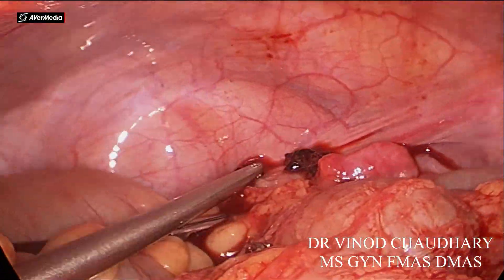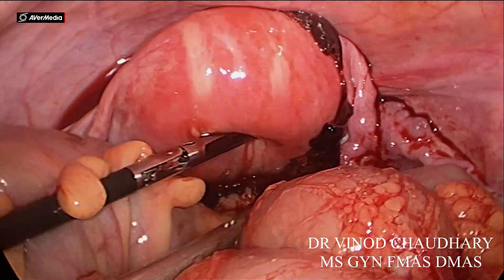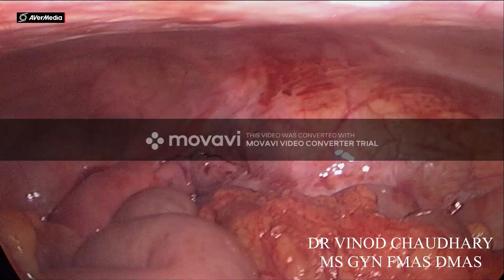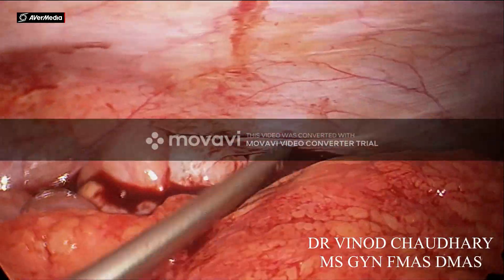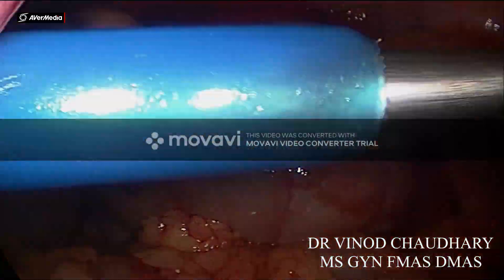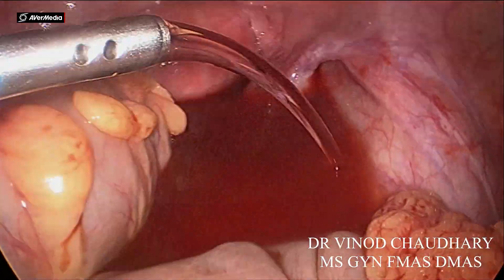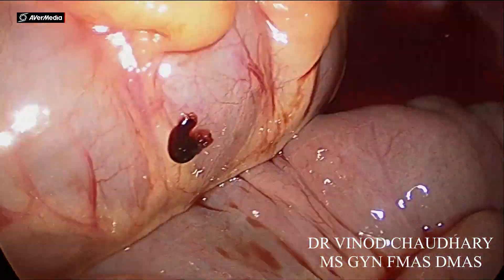We are irrigating some fluid just to clean up. You can see the visibility is improving compared to before. The reason is that blood absorbs all of the light and we are unable to see properly. Now we are just cleaning.